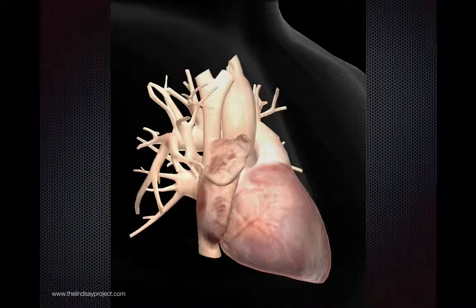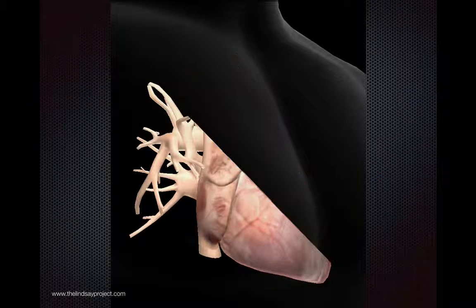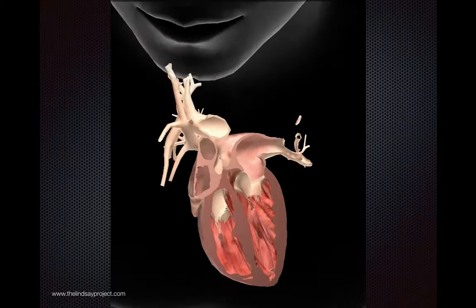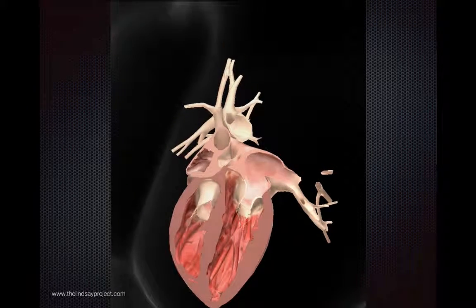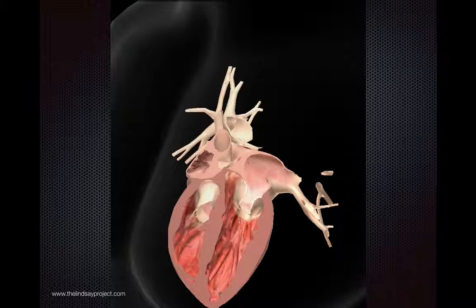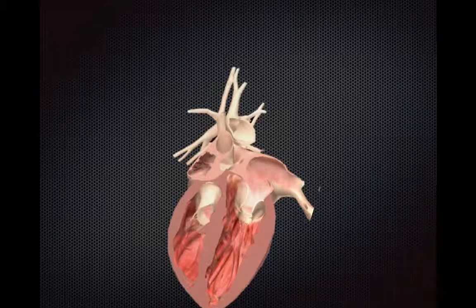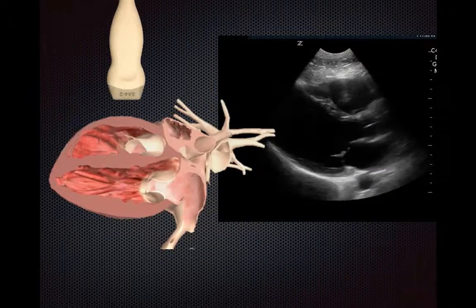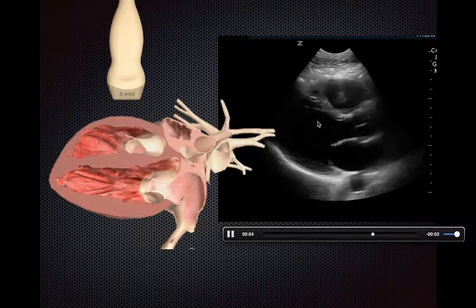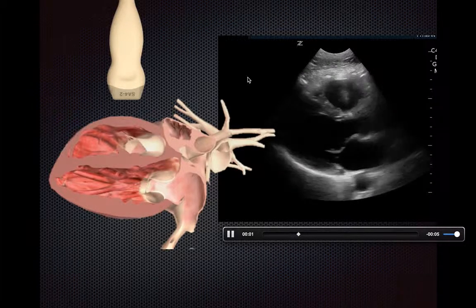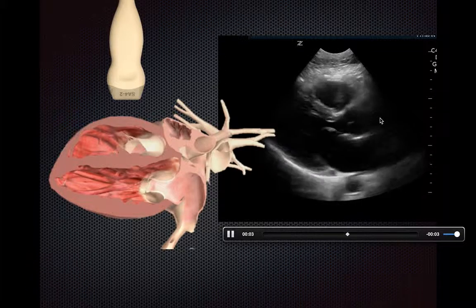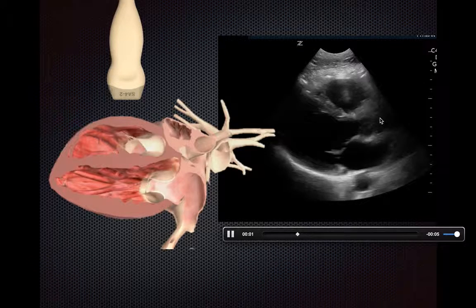The rationale for that is that for both conventions, what you're doing is taking a parasternal long axis through the heart and rotating it around. I think of it as standing on the patient's left-hand side and looking into the heart. Both of those conventions will generate a very similar image. You've got your right ventricle, your left ventricle with the apex pointing to the left, your left atrium, aortic outflow, aortic valve, and aorta.